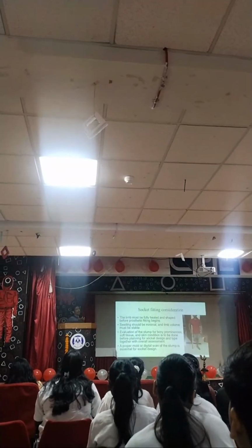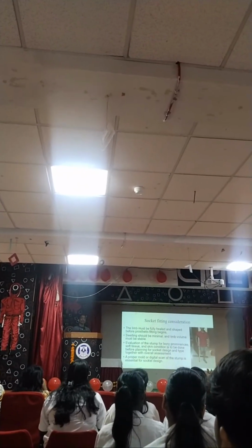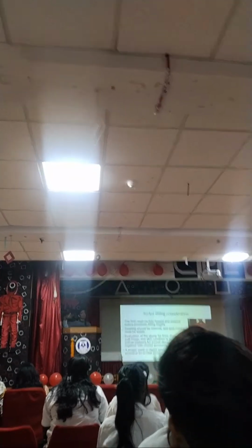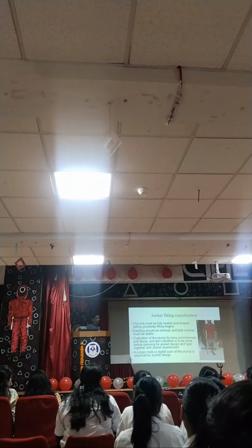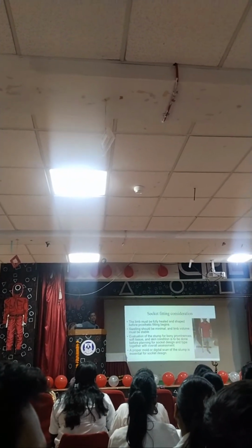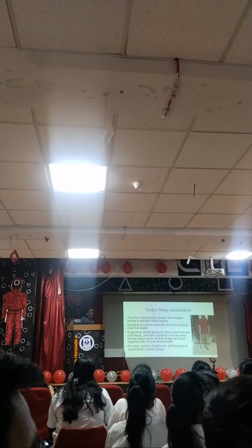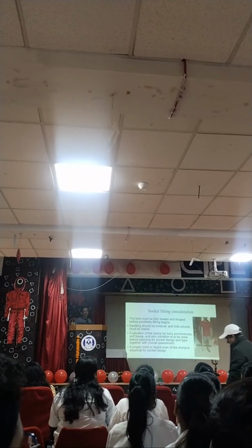We can say the socket design depends not only on the medical or clinical evaluation, but also on the patient's other needs, like the patient's activity need, what the patient wants to do with the prosthesis. So that is also going to affect the socket design. What is the patient participation need, or what is the environmental condition the patient is in. All these are going to affect the socket design together with the whole prosthetic design.